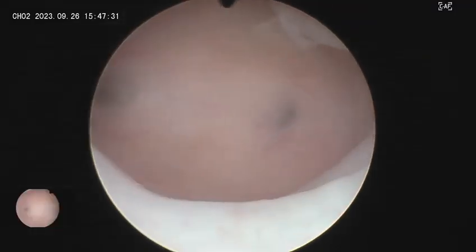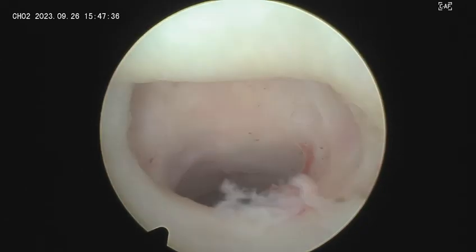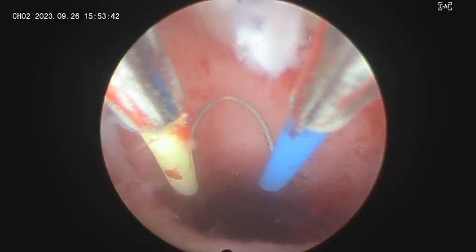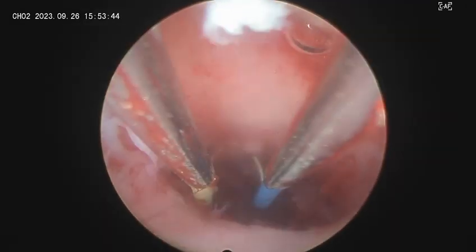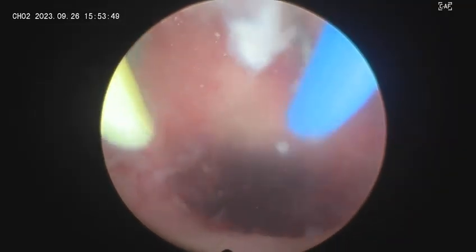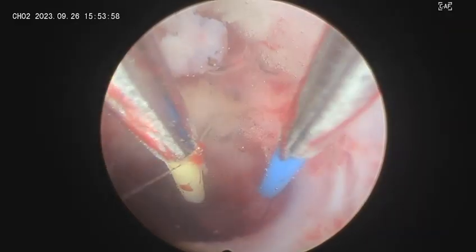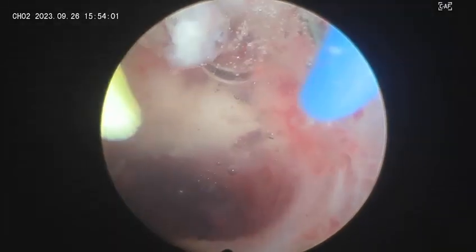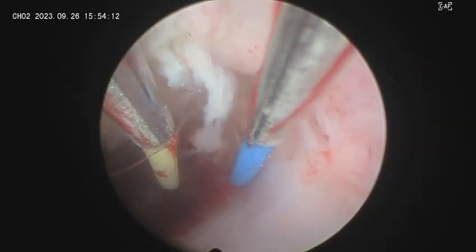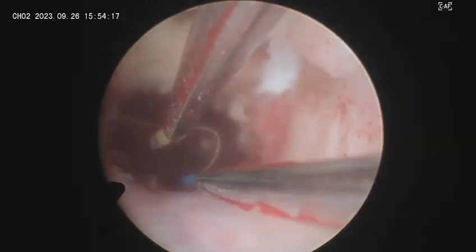It can cause abnormal uterine bleeding as well as fluid in the endometrial cavity affecting the frozen embryo transfer. You can also see that the cavity above the isthmoscele was normal. So now we proceed with the resectoscopic resection of this cephalad and the caudal ridges with the cauterization of the base. A loop electrode is used for this. A cautery setting of around 70 power watts has been used in this case.